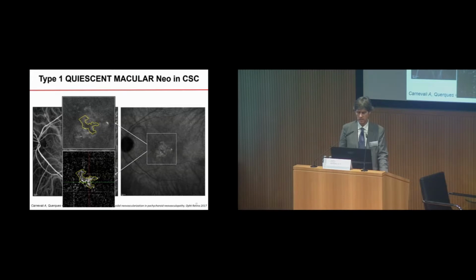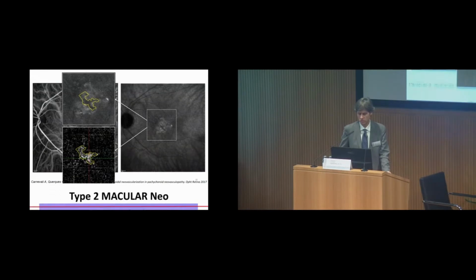So you can see here that in central serous retinopathy we don't have a late plaque for the type 1 neovascularization, but rather we have a washout of the neovascularization. So you have to look at the hypofluorescence on late phase ICG, and then you can nicely see the high correspondence between what we see nowadays with OCT-A and what could be detected on ICG as type 1 neovascularization. Highly correspondent. This was published in Ophthalmology Retina.